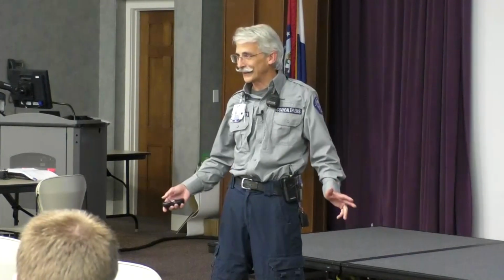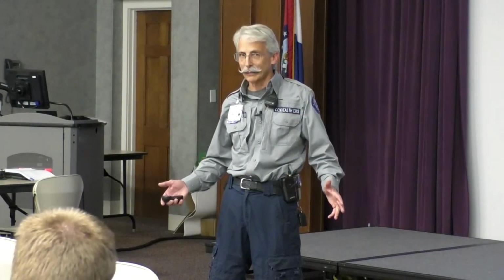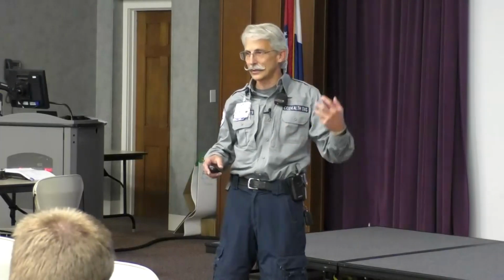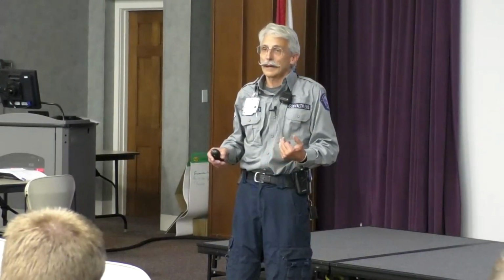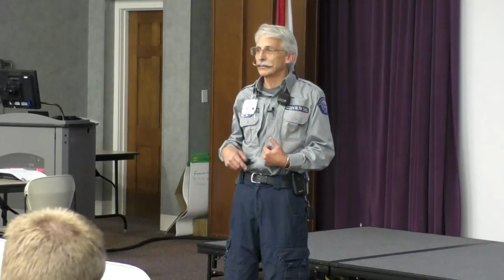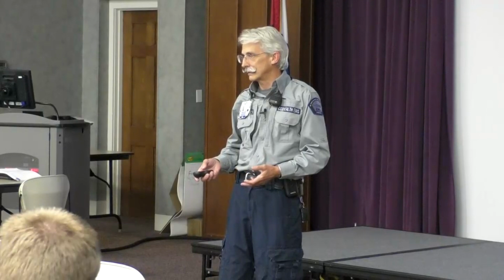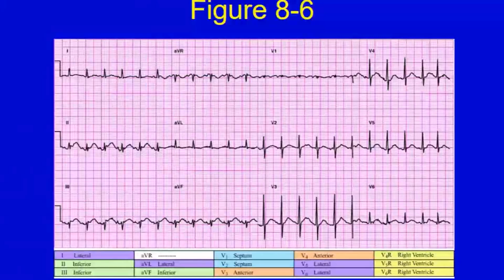How's my patient presenting? Still important. It's still all about that. So I just kind of ignore that fact of the EKG to a certain degree, and I can tell the hospital what it's got, but it doesn't have to make a lot of treatment decisions for me. How is my patient presenting?